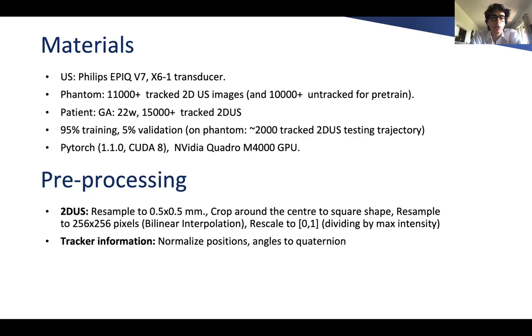In a similar manner, we normalized the tracker information coordinates from 0 to 1, and we converted the inclination angles to a quaternion notation to, at the same time, avoid gimbal lock and provide normalization.